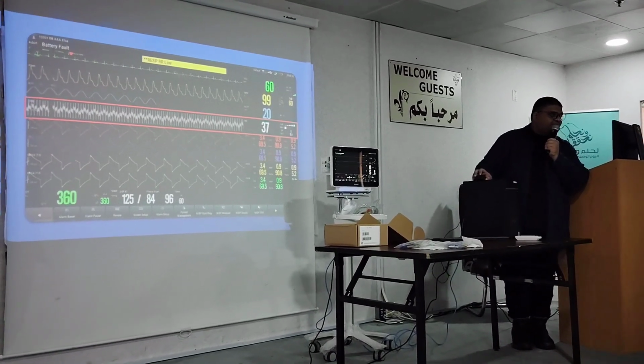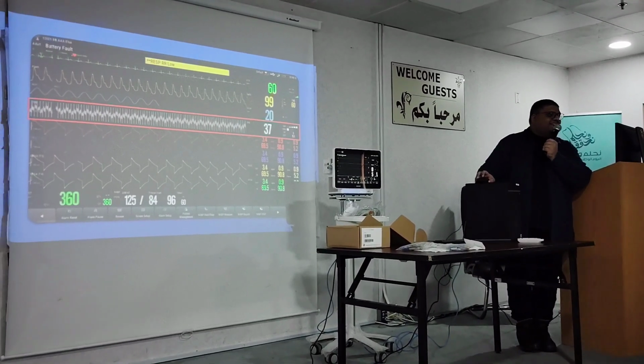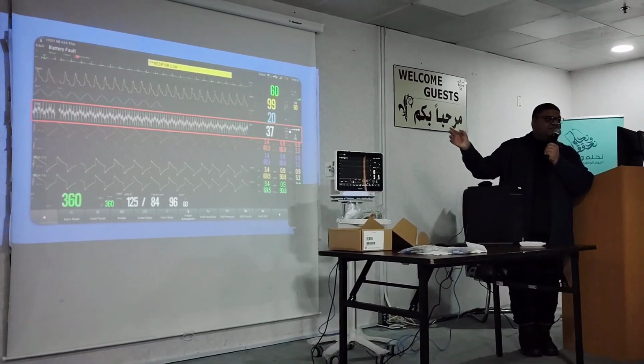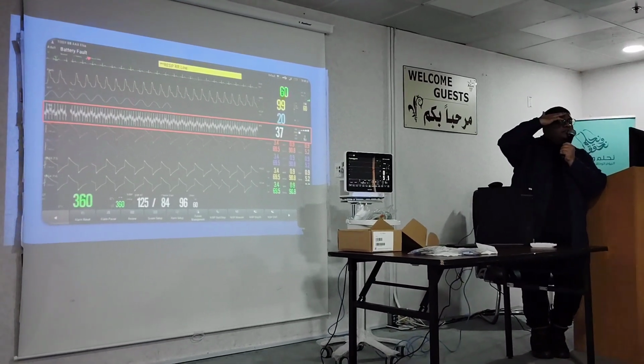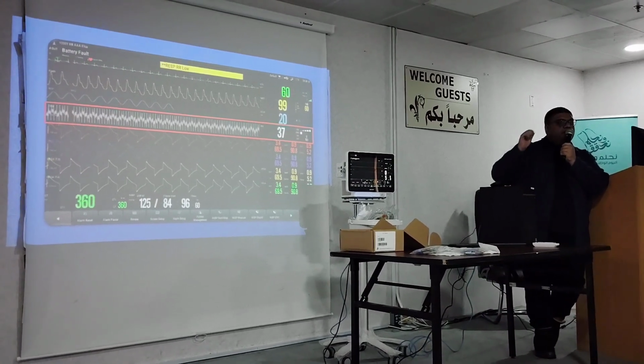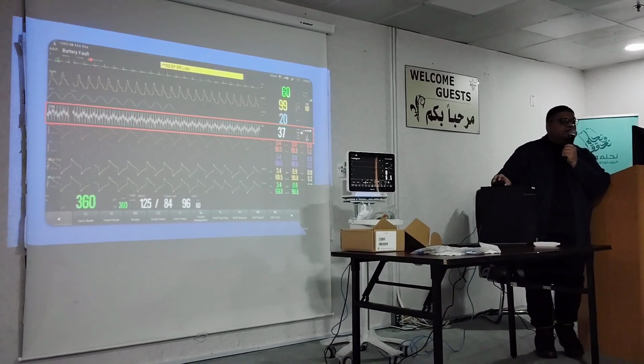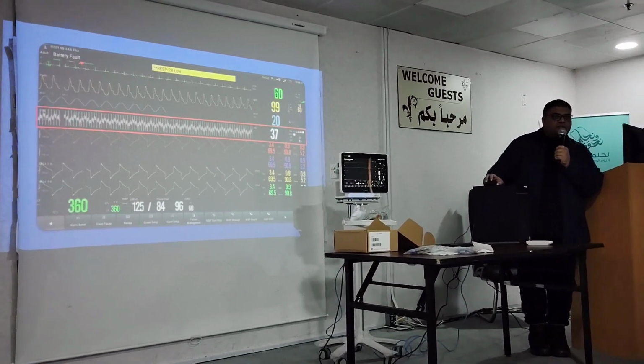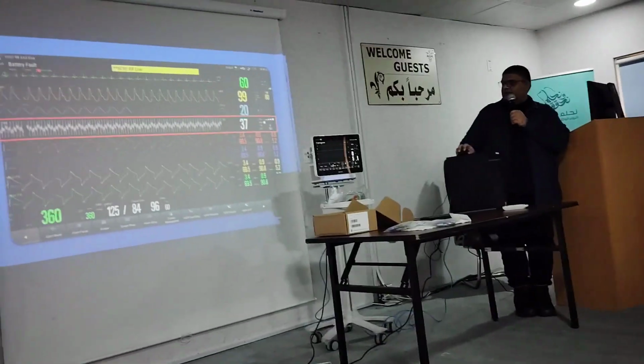Body temperature? No. That's a very interesting way to put it. 37 is the body temperature. But this is bispectral index. So you're using the electrodes on your forehead. Do you know what 37 means here? Anybody?